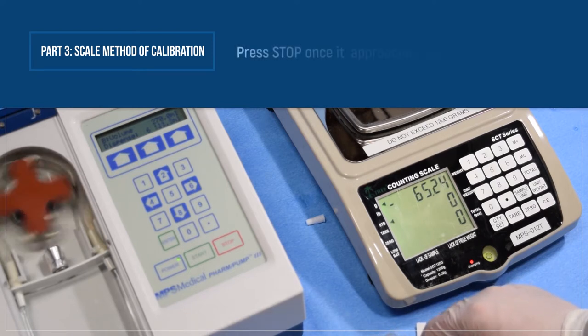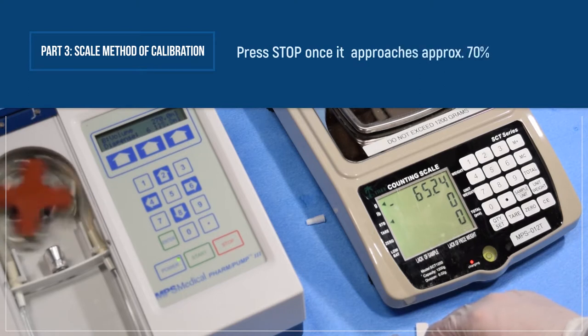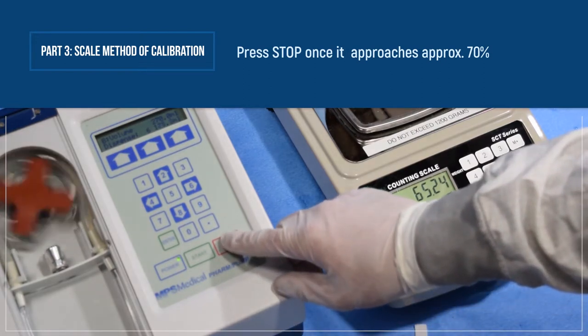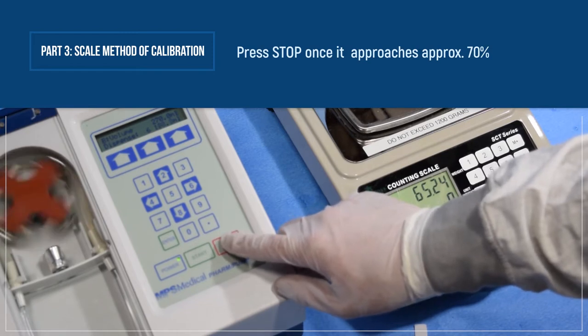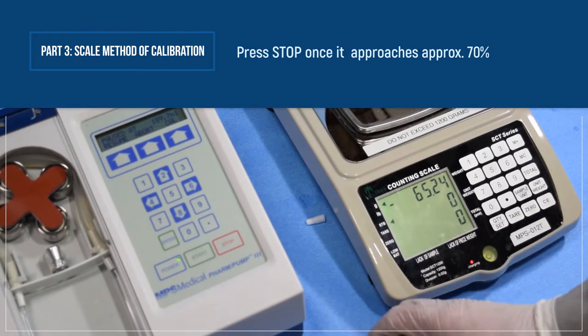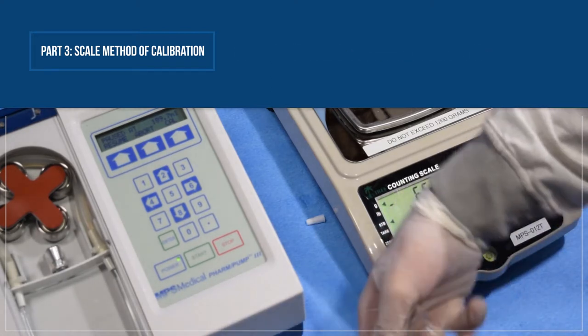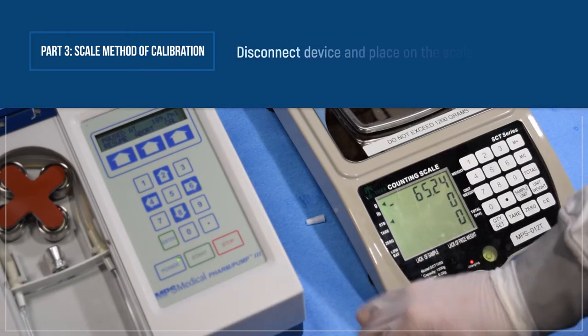Press stop once the total target fill reaches approximately 70%. Disconnect the device and place it back on the scale. Assume 1 gram is equal to 1 mL of volume dispensed.